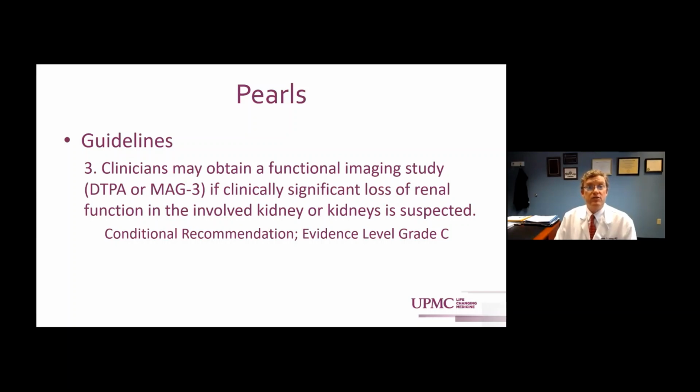And as I also mentioned, you can usually get most of this information, at least not in an acute setting, just from CT parenchymal volume. Some radiology departments can probably do that for you. Ours can do that for livers, but doesn't typically do it for kidneys. But a lot of it you can also do yourself just by eyeball.